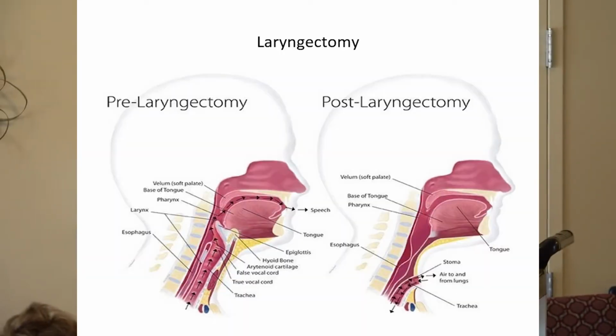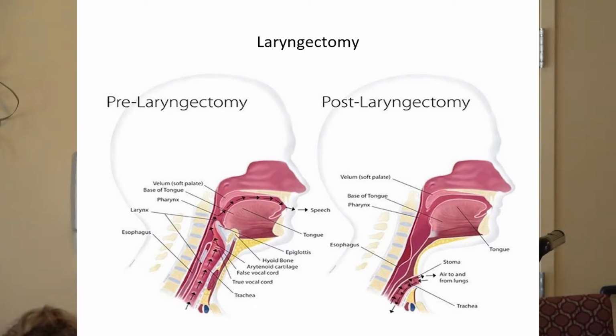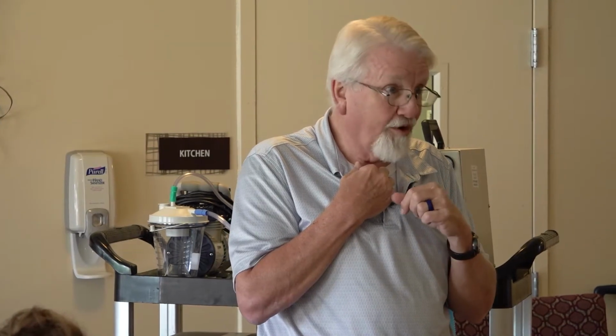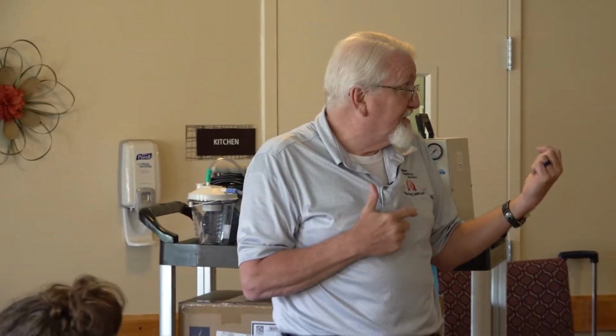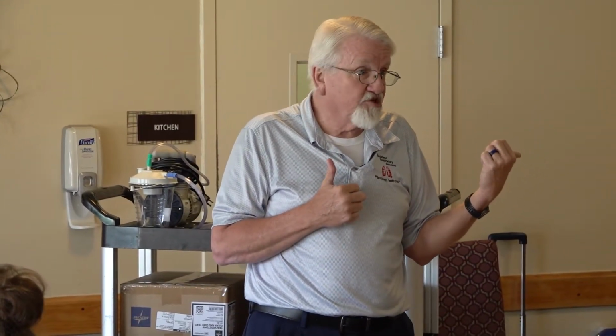So with the laryngectomy, you have a true full neck breather. If I go like that, he can't breathe. From an RT standpoint, I would rather have 6 laryngectomies than 6 trach patients. Why? That stoma's been surgically created, so whatever they may have, a Stabilibase or Larry tube, whatever, if it comes out, I don't have to wonder how long it's been out, is it closed up, am I going to be able to get another one back?